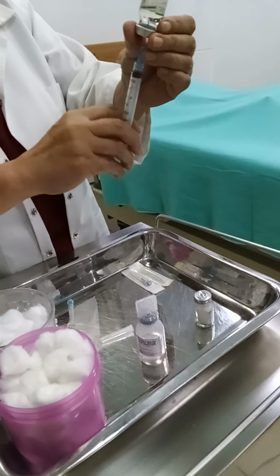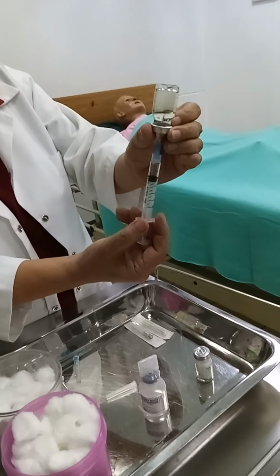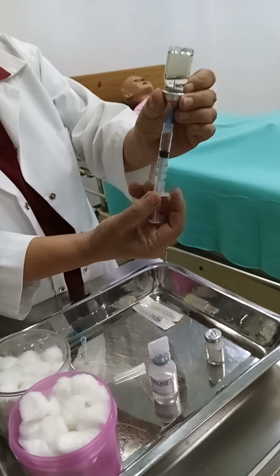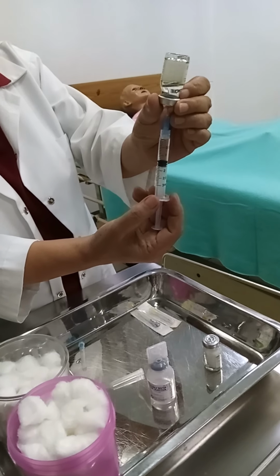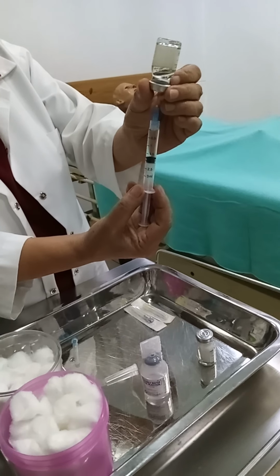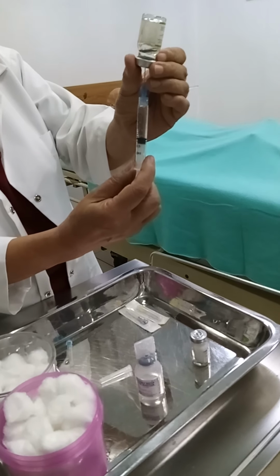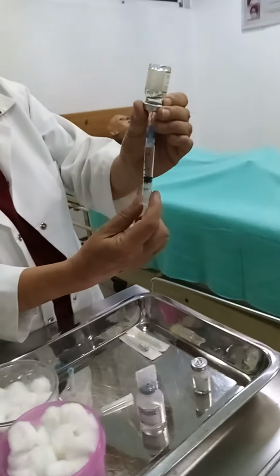Keep the tip of the needle below the fluid level. Allow air pressure from the vial to fill the syringe gradually with medication. Then pull back the plunger slightly to obtain the correct amount of medication.